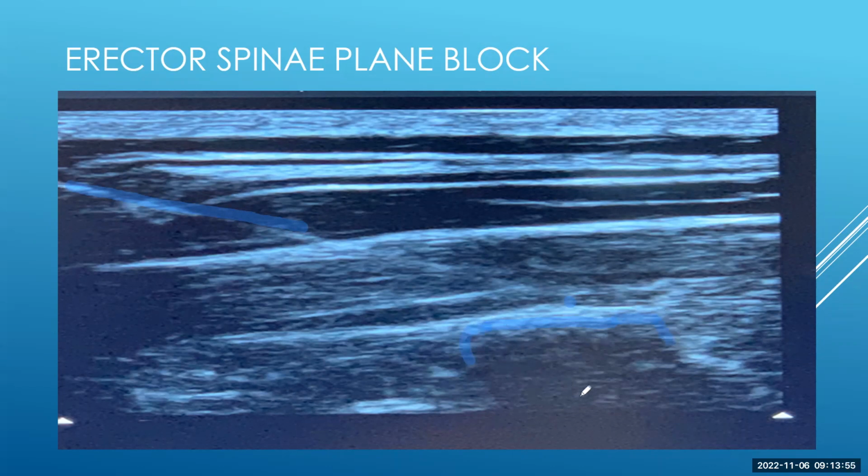And we notice this dark area behind the hyperechoic area right here. That dark area is, remember, this is an ultrasound. It's not an X-ray. You can't see past that. So basically, it hit that hard structure, bone, the transverse process, and came back with a very strong signal. And that's why it's hyperechoic. But there's no image here to tell us what's in this area. We know that that is the transverse process, and that's the bone, but it could be a little bit misleading if you're wondering, is that a blood vessel maybe over here? You're not going to be able to see that because it's being distorted by that hyperechoic or very dense bone.